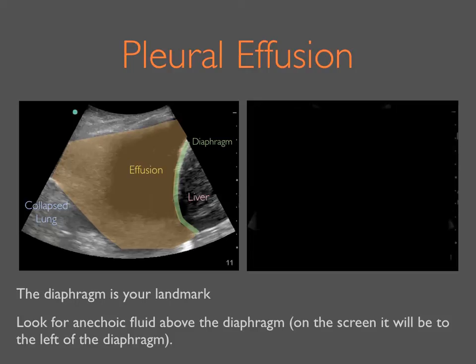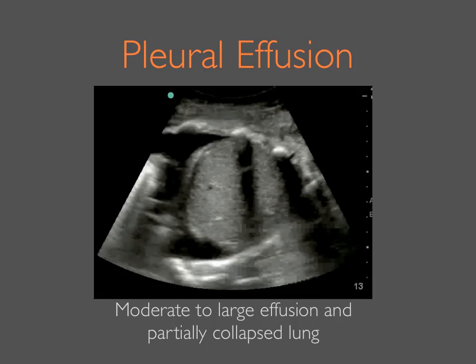Here we see a moderate to large effusion with partially collapsed lung. In this example, we see a hemithorax entirely filled with fluid and a completely collapsed lung floating inside. The diaphragm is not evident in this example.